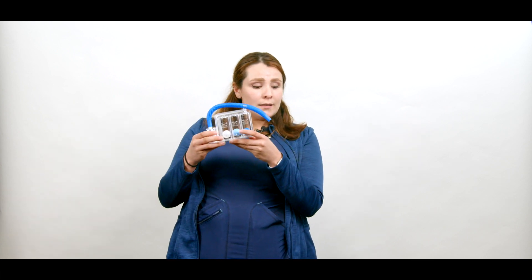Hi guys, this is Dr. Alma and I'm going to be part of your follow-up team. Right now we're going to talk about how to use your incentive spirometer. This is a device that will help you measure how much air goes into your lungs.